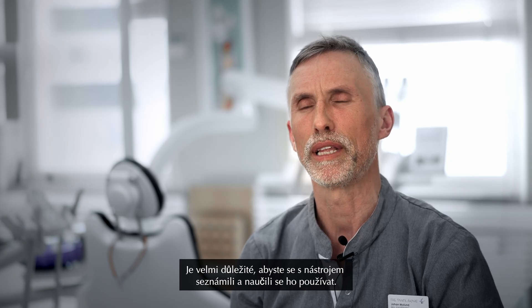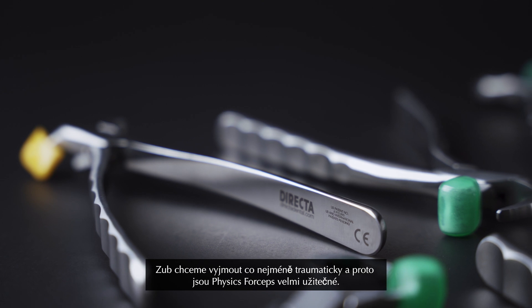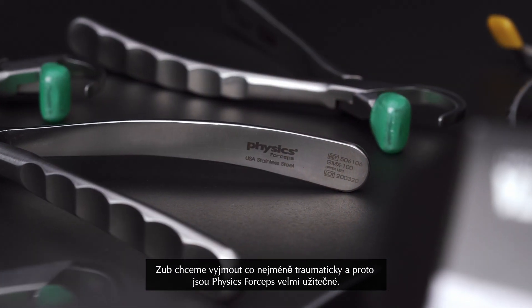It's very important that you get to know the instrument and learn how to use it. You want to take out the tooth as atraumatically as possible, and that's when the Physic forceps is very useful.